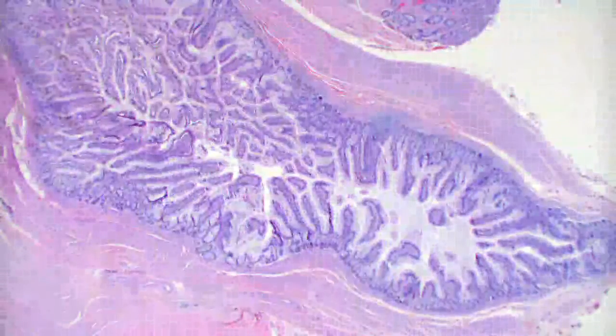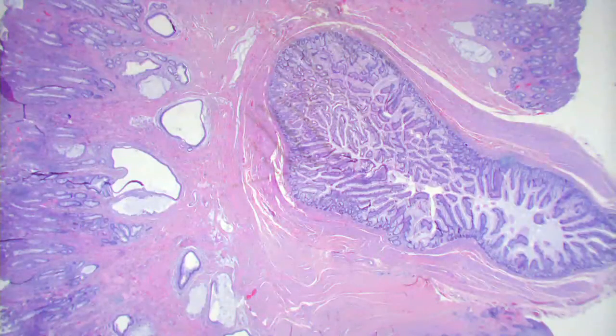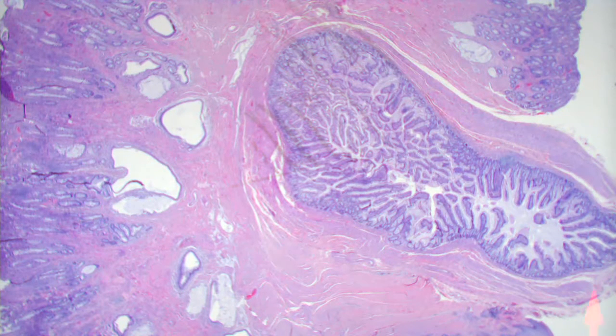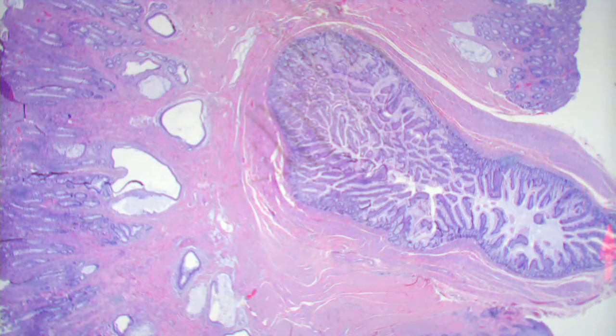It could be a congenital umbilical polyp. That's what I was thinking. Okay. Architecture, like the lower magnification. What is the shape of the lesion? Polyp. Yeah, it looks like a little polyp, doesn't it? It's kind of a sessile lesion here. It's dome-shaped. And it's got a little central sort of almost core, if you will, and then it's got maybe some fibroplasia surrounding this, and then it's got this superficial erosion.